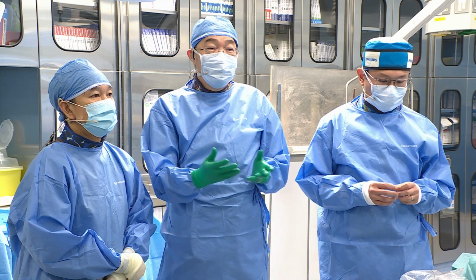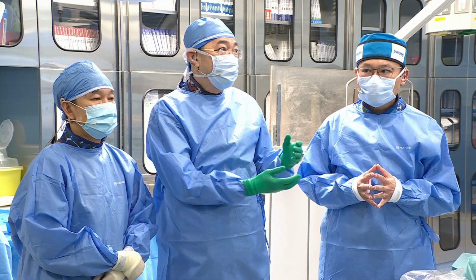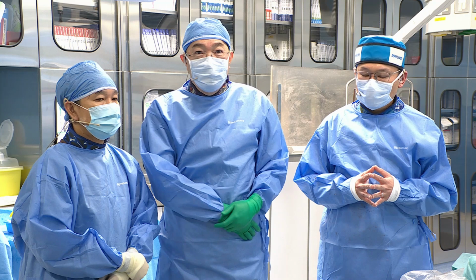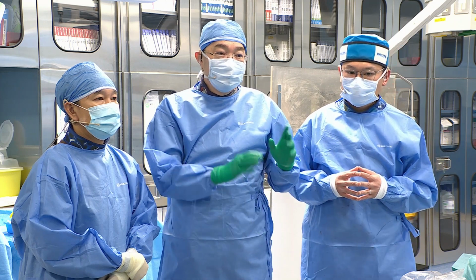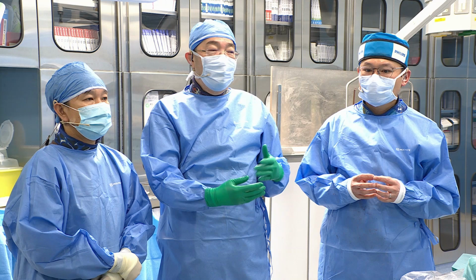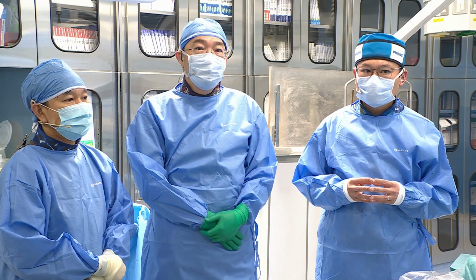Just one last word. Perfection is the enemy of good. So I think with this sort of result, it's acceptable. If you want to have a perfect result, you use a bigger OPN balloon, and may eventually end up with a perforation and some complications. So as long as the lumen size is adequate, I think this sort of imperfect result is acceptable. I don't think there's any other method that can actually achieve a full lumen expansion in this case, for very eccentric, thick calcium.